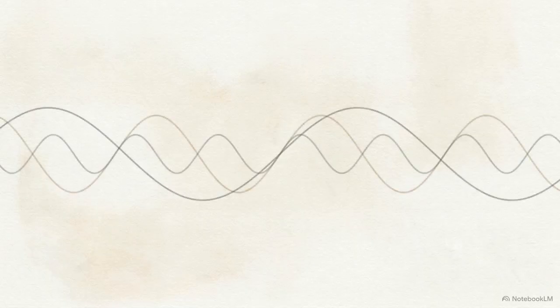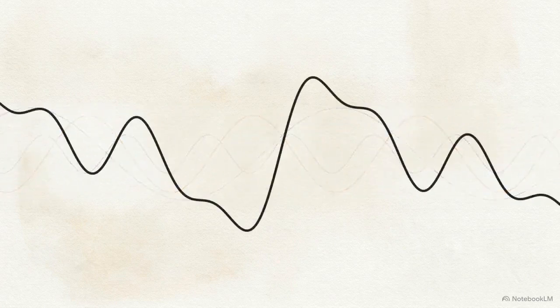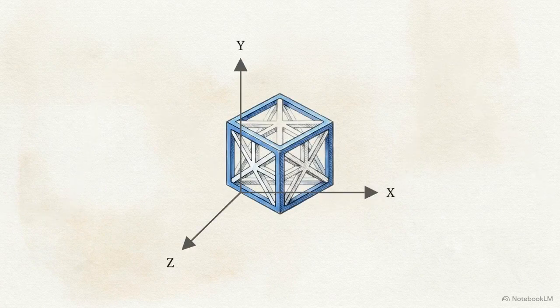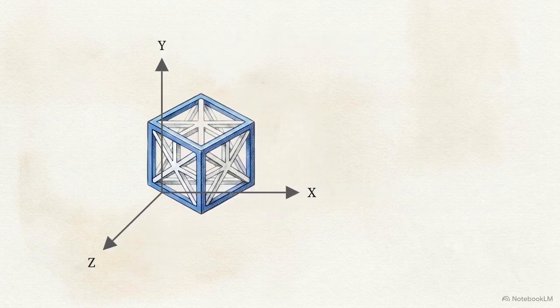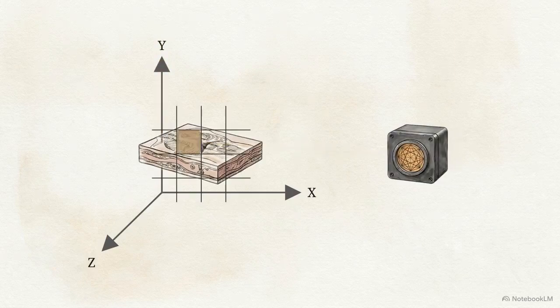It arrives at the receiver coil as a single chaotic chorus of radio waves stacked entirely on top of each other. To extract an image from that noise, we have to artificially map the three-dimensional space. We do this through spatial encoding, deliberately manipulating the magnetic environment so protons at different locations behave in predictable, measurable ways. We isolate the anatomy step by step, axis by axis. We start with the z-axis to select a single slice, then map x-axis by frequency and decode y-axis using phase.